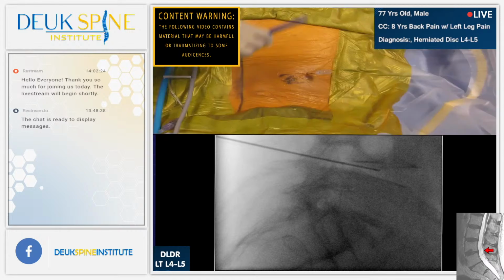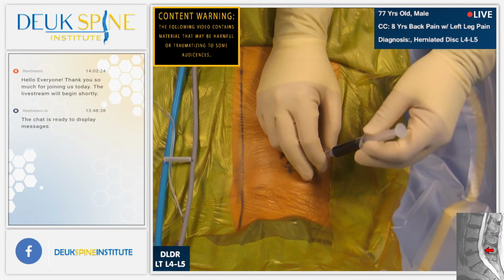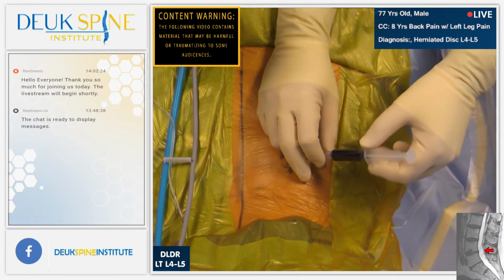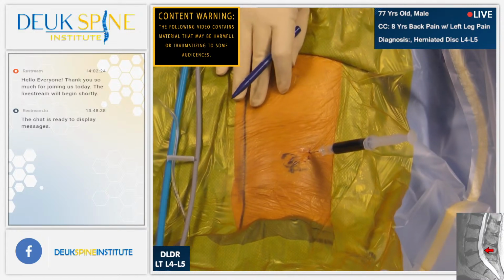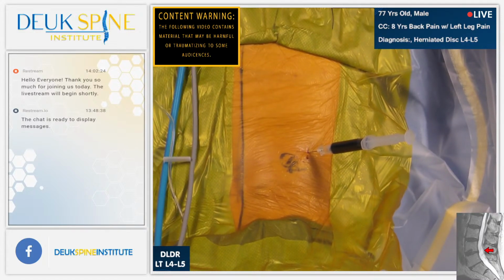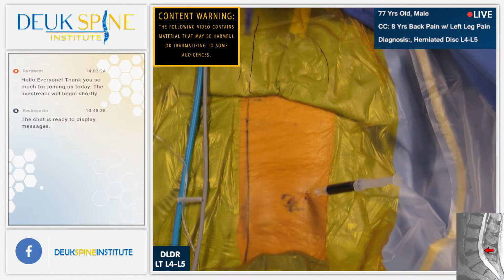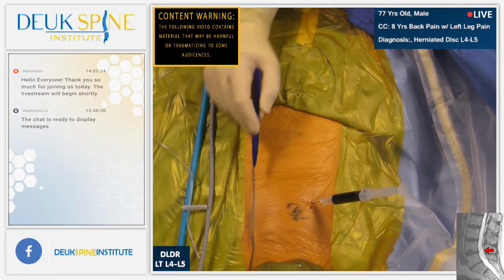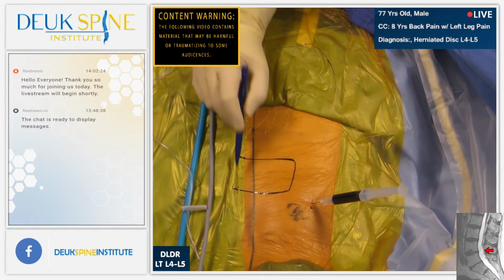He's moving around a little bit because we're in the painful disc, right? We think this is the painful disc based on his MRI and based on where he showed me his pain was. So for those of you watching, his butt cheeks are right there. The top of the butt crack is here. And basically, when I asked him, where is your pain that you get? He told me it's in this area here.